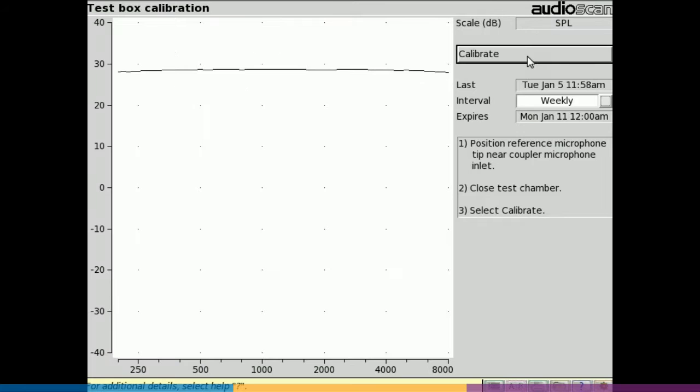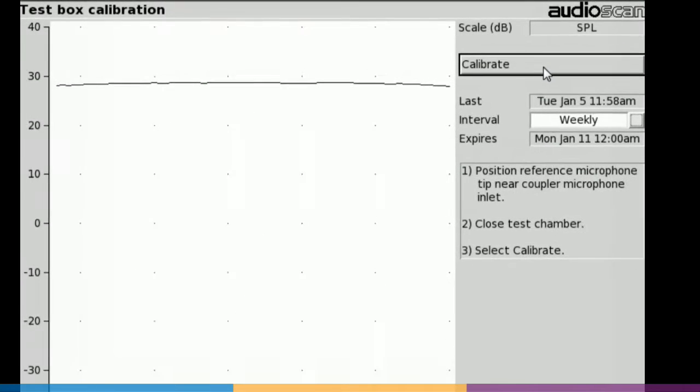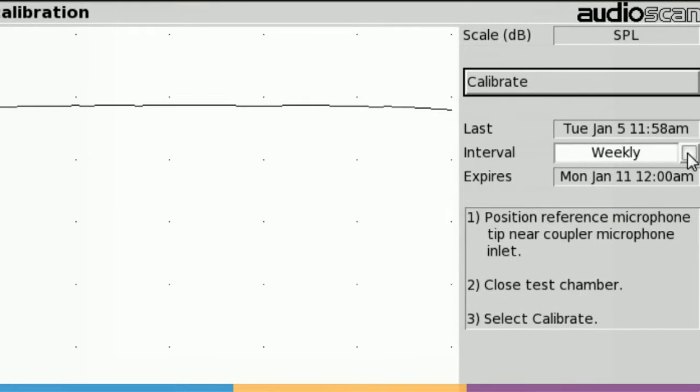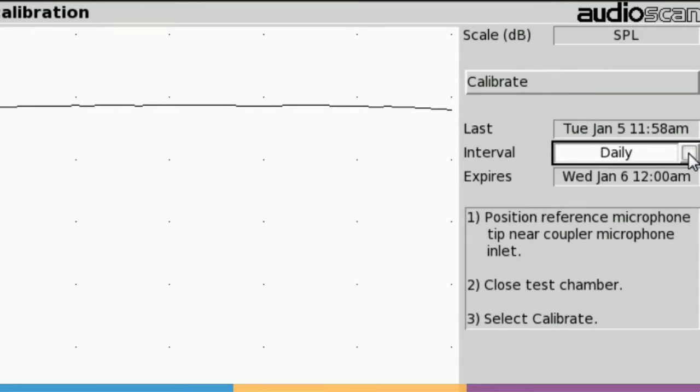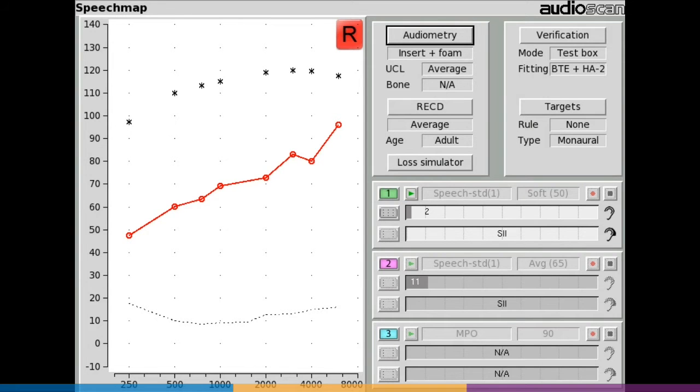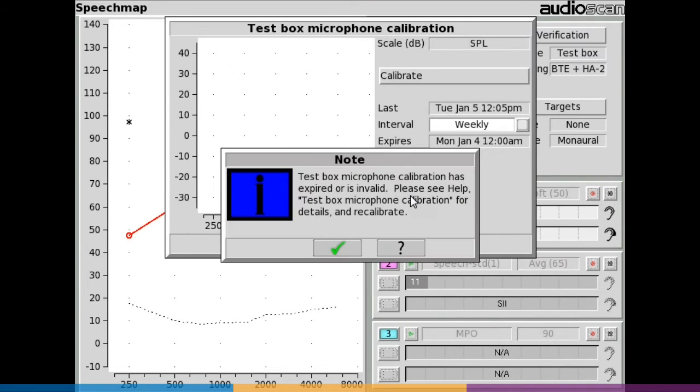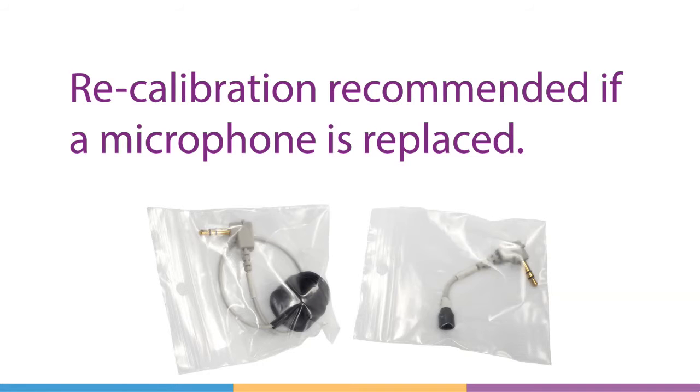Calibration can be performed as often as desired but will expire at 12am the following day or 12am the following Monday, depending on your choice of daily or weekly calibration interval. After the calibration has expired, you'll be prompted to calibrate whenever you attempt a test that uses TestBox microphones. You should recalibrate if either microphone is replaced.